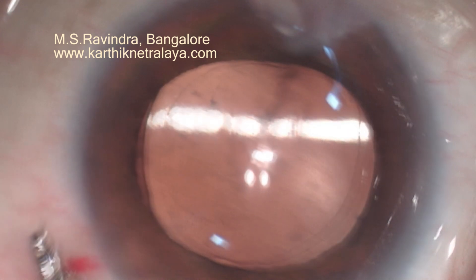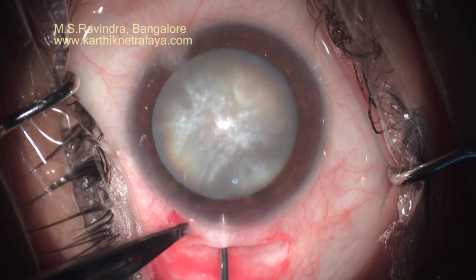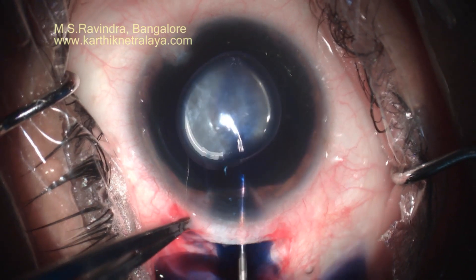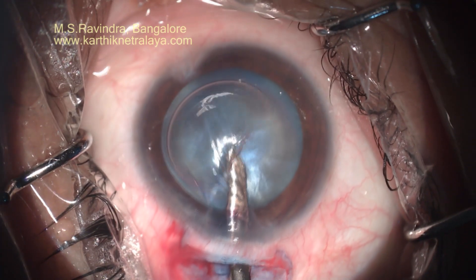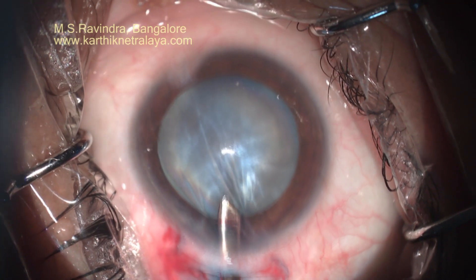This is a marvelous video showing that zonules are porous and fluid in the anterior chamber can reach the vitreous cavity. I have demonstrated this time and again. Trypan blue injected in a closed eye, without letting the aqueous ooze out, can percolate through intact zonules into the vitreous cavity.